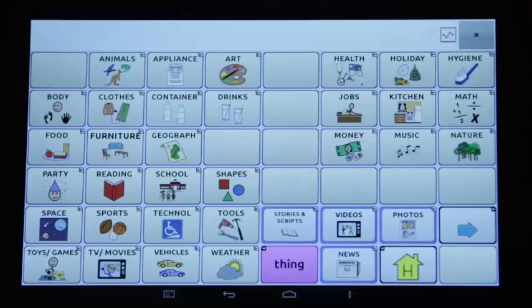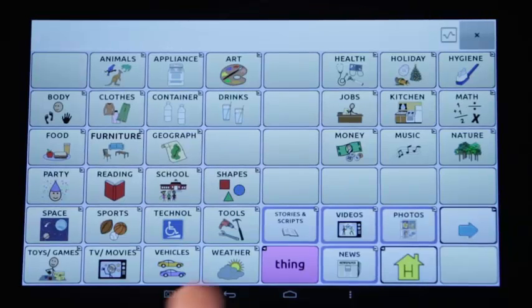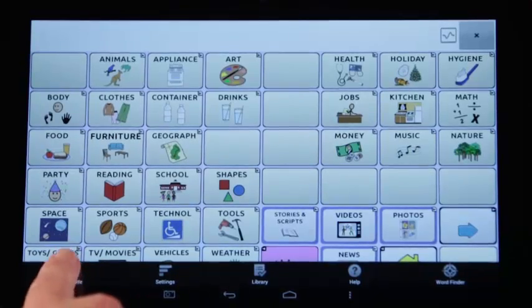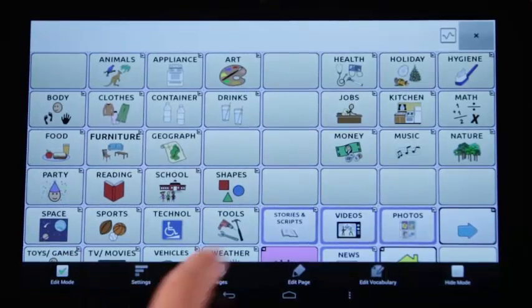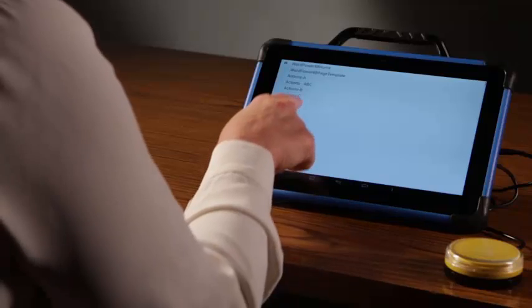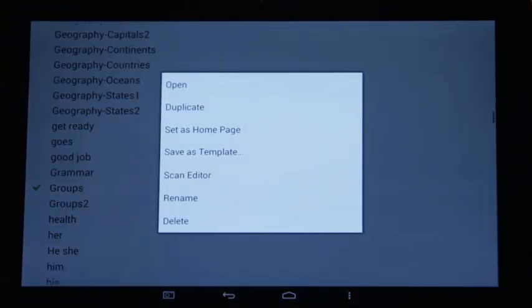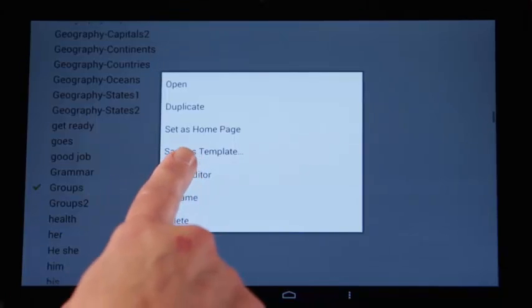We will tap the groups page. For this demonstration, I am going to create a custom scan for the groups page. The groups page has already been edited and rearranged to allow alphabetically ordered blocks and an other block. To create a custom scan, I need to access the scan editor through that page. Tap Menu and Edit Mode. Tap Pages, scroll to the page we wish to customize the scan on, which will be our groups page. Tap Groups, and we see Scan Editor is one of our options. Tap Scan Editor.